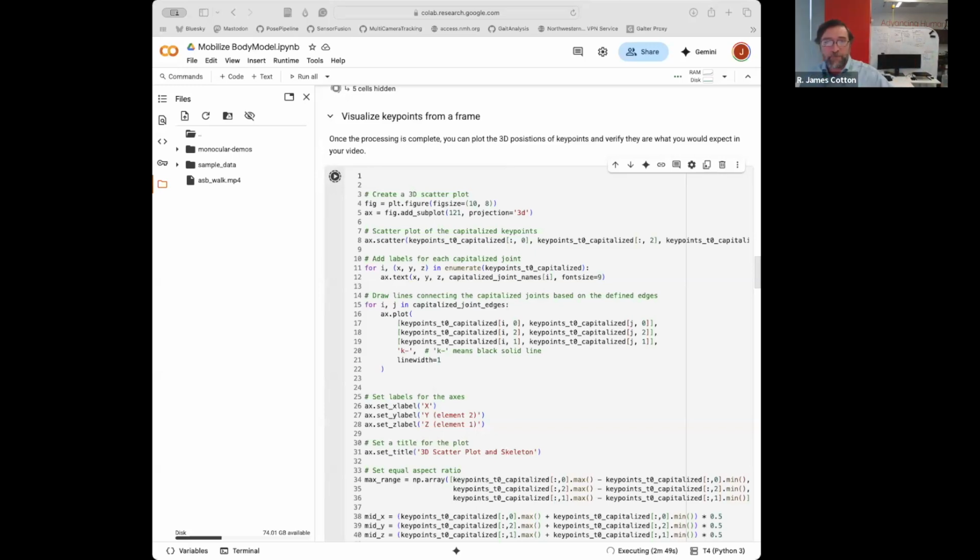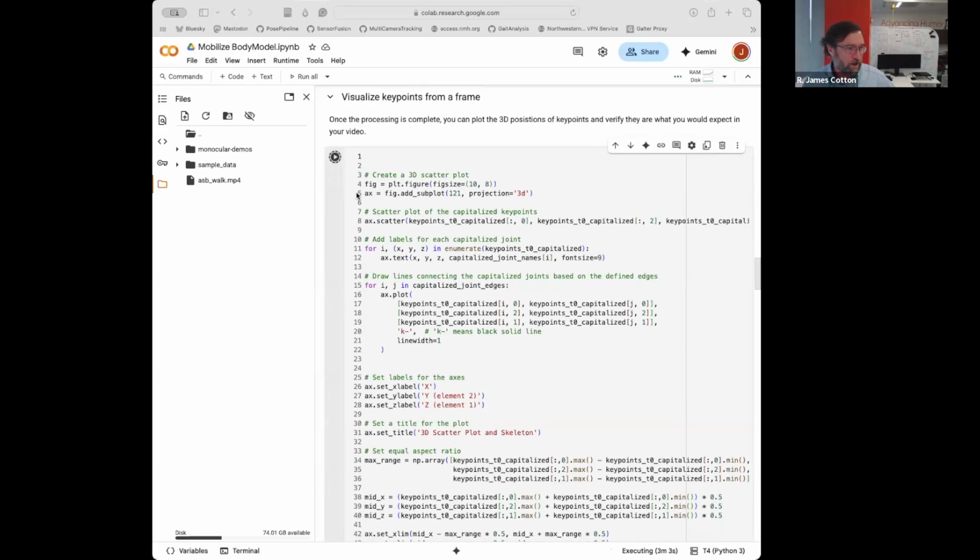And actually, my R01 is entirely on balance and stability in prosthesis users. So we actually send people home with wearable sensors. We have a cloud infrastructure that's collecting data, so we can track the kinematics of every step they take. So we want that to be accurate, but we don't see any evidence it's much different other than the pelvis when they're sitting.